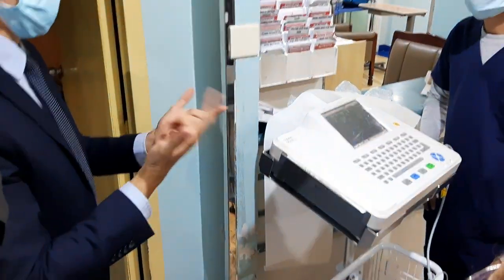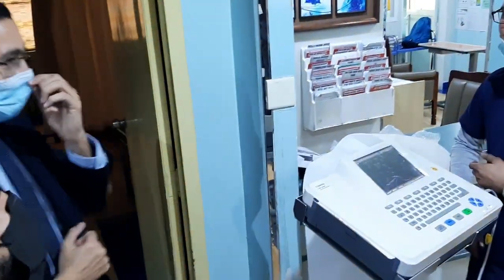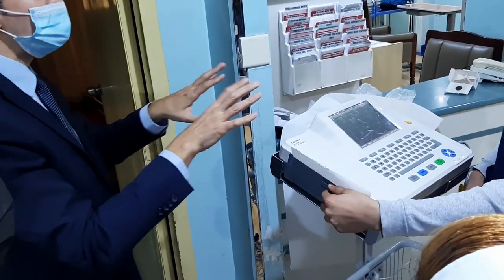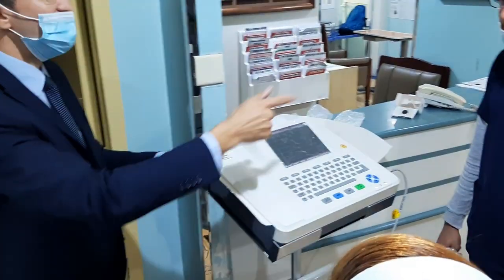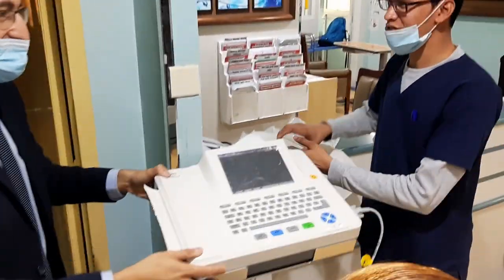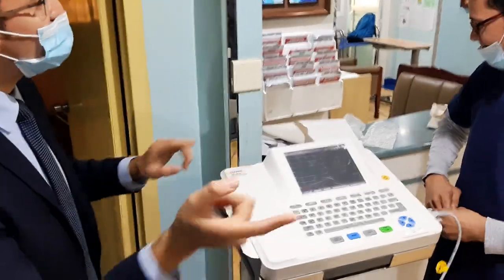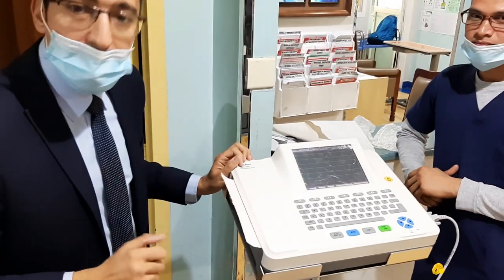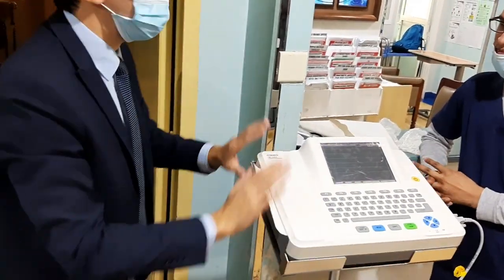If in case it's broken, what do we do? Broken, you need to change. You will purchase. You should be given extra. Let's be careful, so many times we can use. Bring extra. Maybe sometimes I request extra ECG paper. Be careful in using because you're the one responsible. Prevent it, and if you make 10, it will be no problem.